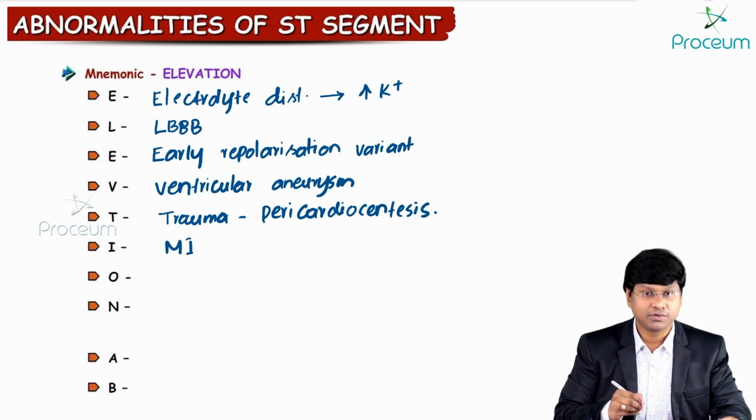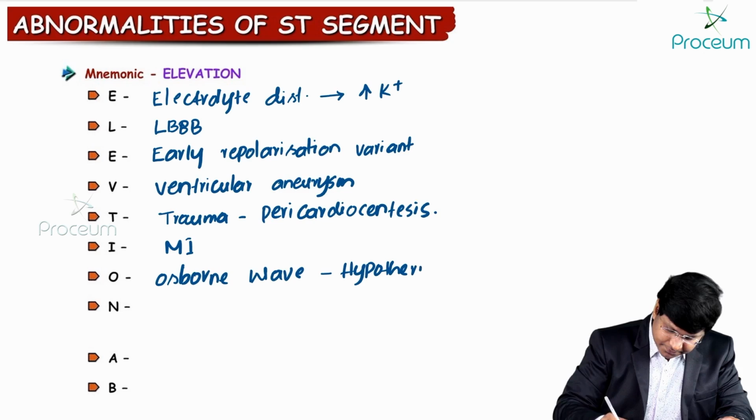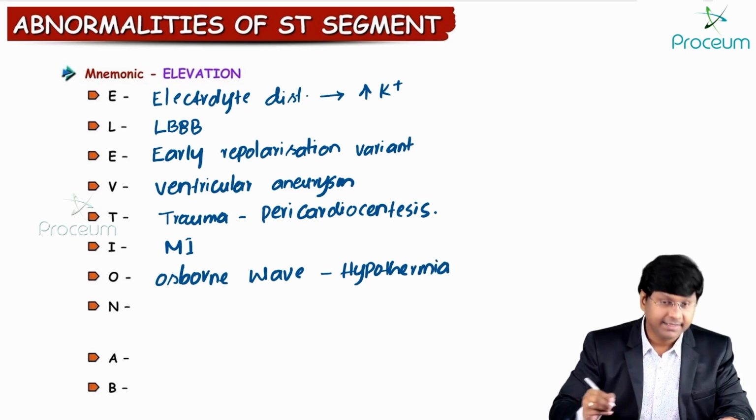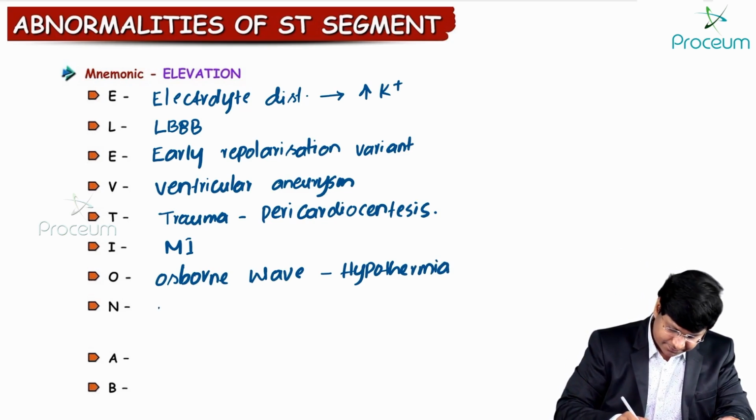The word O stands for the Osborn wave. And this particular Osborn wave you will see in hypothermia. And the word N stands for non-occlusive vasospasm.